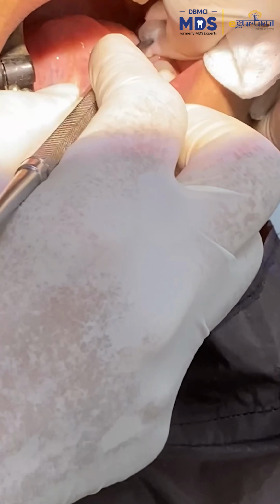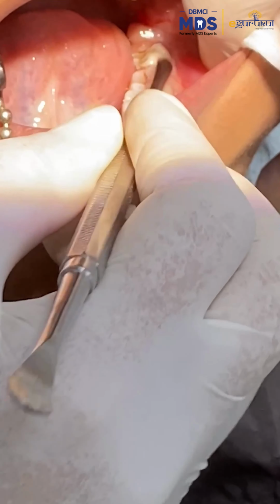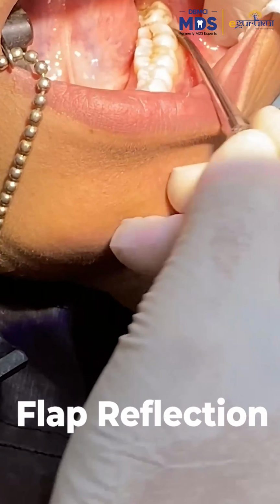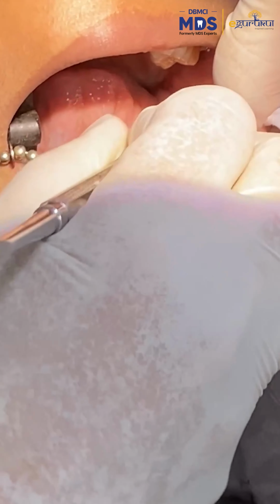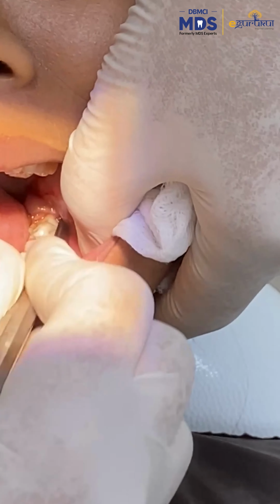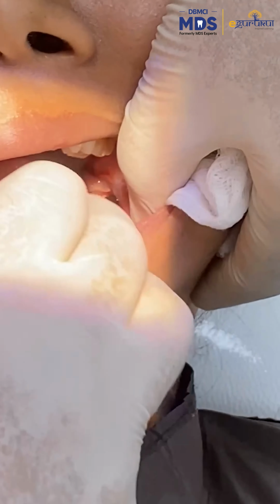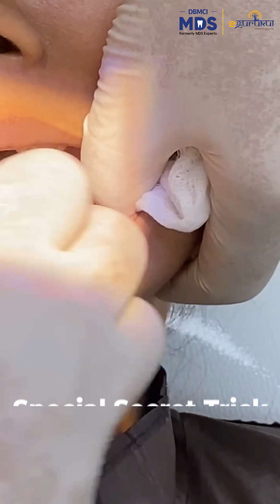Now I start reflecting the mucoperiosteal flap here, trying to remove as much flap as I can from the third molar region. You can see there is a lot of soft tissue distal to the third molar, and I reflect as much as I can from the buccal side. You don't have to touch the lingual side much because of the lingual nerve. From the buccal side I am extracting, and this is the trick.